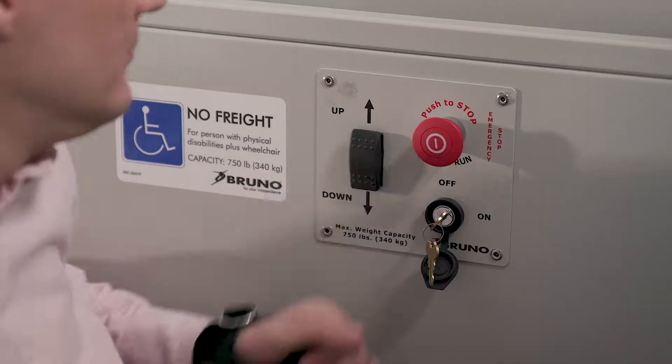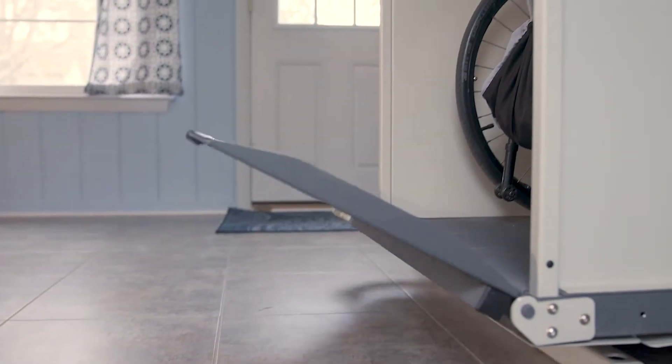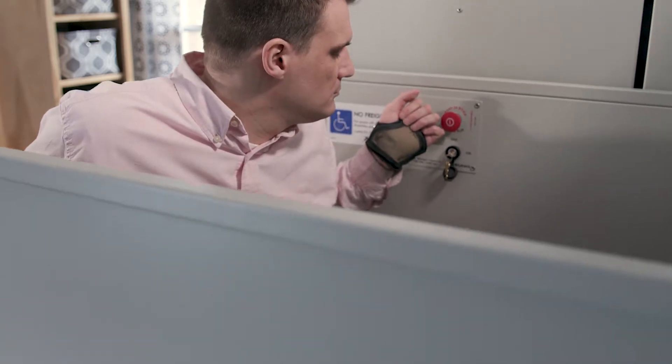Heights available up to 14 feet. With available DC battery power, you can rest assured the lift will operate even in a power outage.